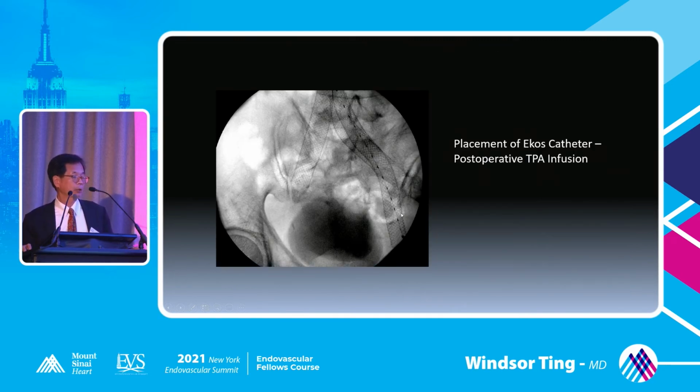Occasionally, at the conclusion of the intervention, you see there's still a fair amount of thrombus within the vein. And in those cases, I will consider putting in an infusion catheter to infuse TPA for some period of time. I usually use 0.5 milligram to 1 milligram of TPA per hour. And I may infuse for 6 hours, 12 hours, 24, sometimes even as long as 48 hours. And then depending on how the patient does, I will take the patient back for a second look.